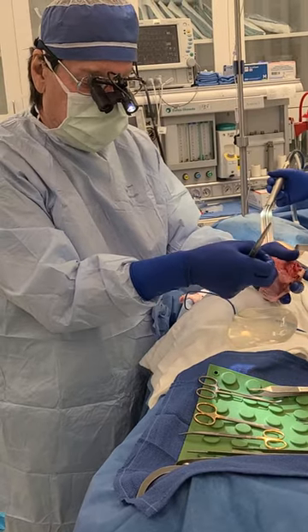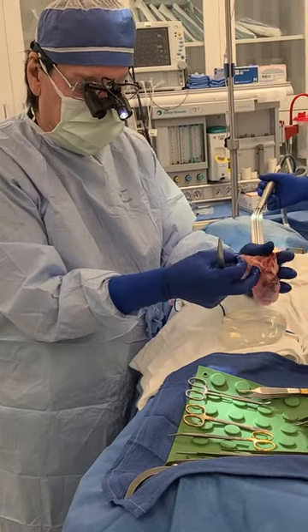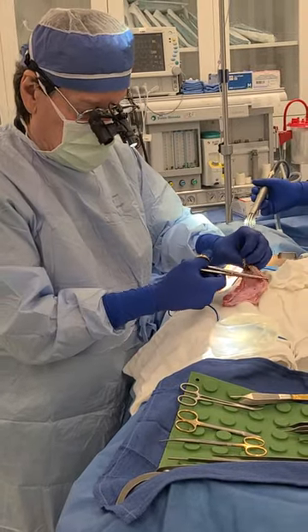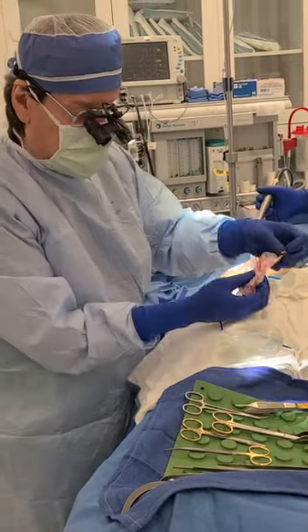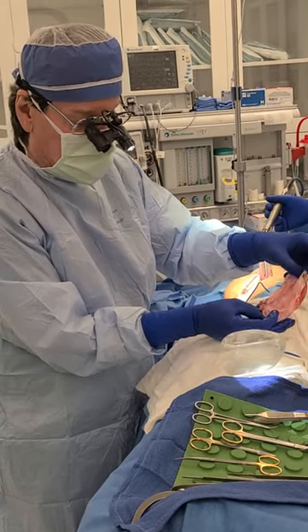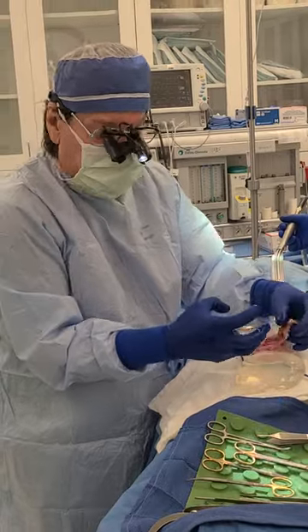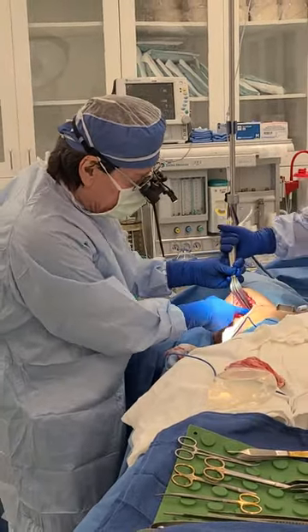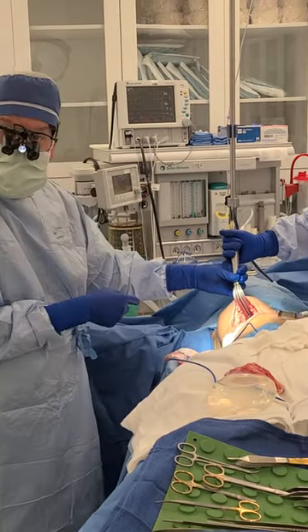And here is the entirety of the capsule. You see that the capsule is not overly fibrotic, it's not calcified, it's a bit thick, and it's been squeezing the implant and holding the implant up in an abnormal position.